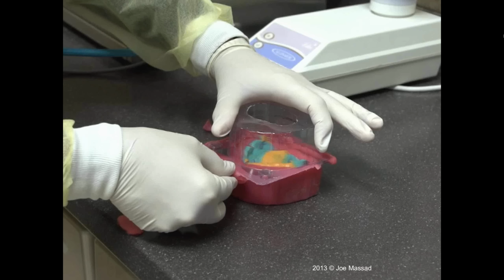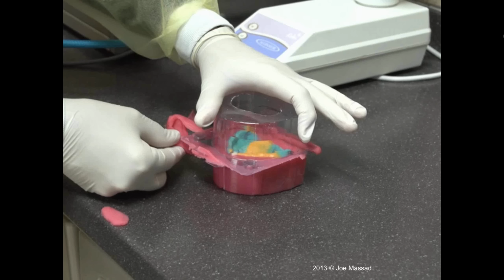I've had questions before about this material and the cost and the usage. You can reuse it as long as the model is disinfected. This will be strictly in the lab. More than likely, you've already disinfected the impression. And if you want to box it and reuse the material, as long as once you've completed with it, the model's been disinfected, it should not really be a major issue. The alginate, of course, can only be used once.